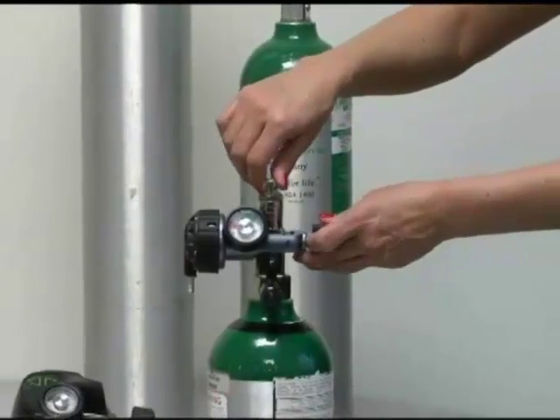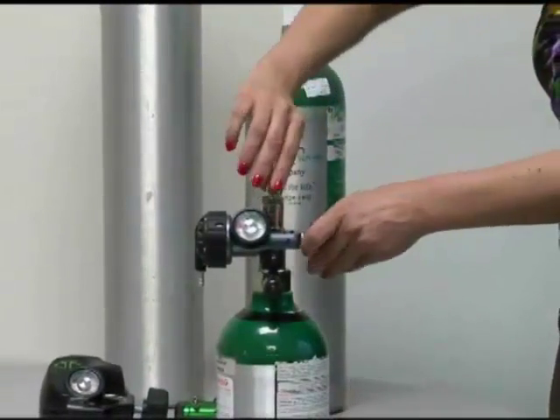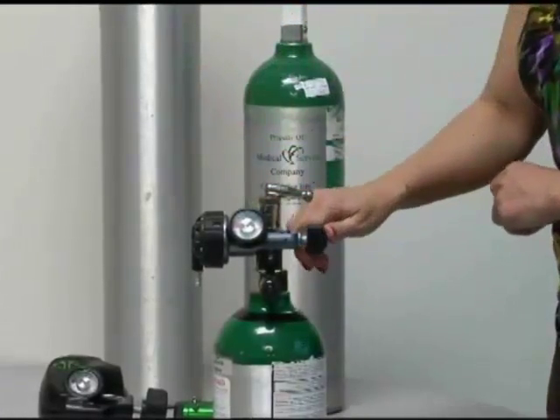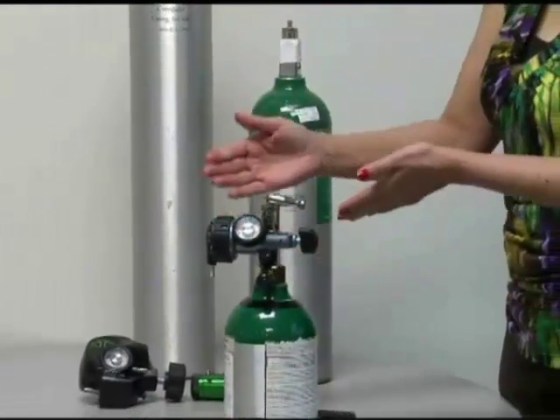When you go to turn it off, take the toggle, turn it halfway back in the other direction, and then your tank would be closed and you could take your gauge off.